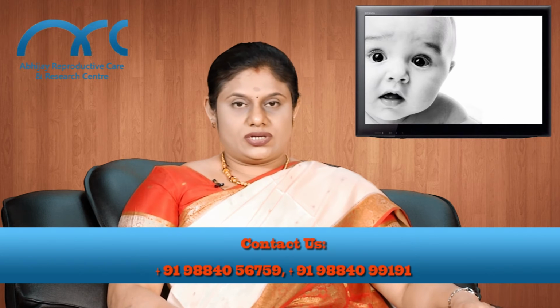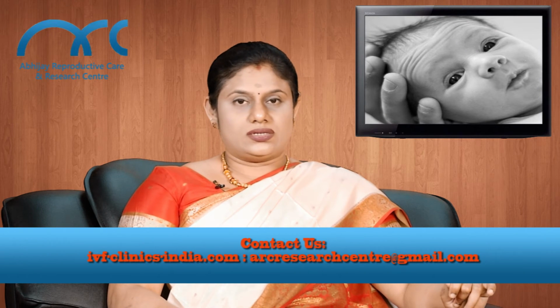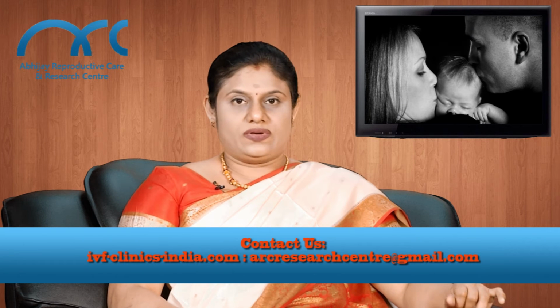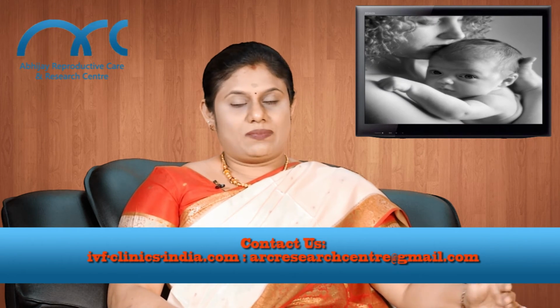There is a group of patients with a very tight cervical internal os for whom either doing an intrauterine insemination procedure or the embryo transfer technique becomes too difficult. These patients benefit a lot by the hysteroscopic guided cervical shaving technique. So whatever the procedure might be, we program them and ask them to come over in a 6 hours fasting status, and those patients who require a laparoscope, we usually combine them with a hysteroscopy to make sure what the pathology is.